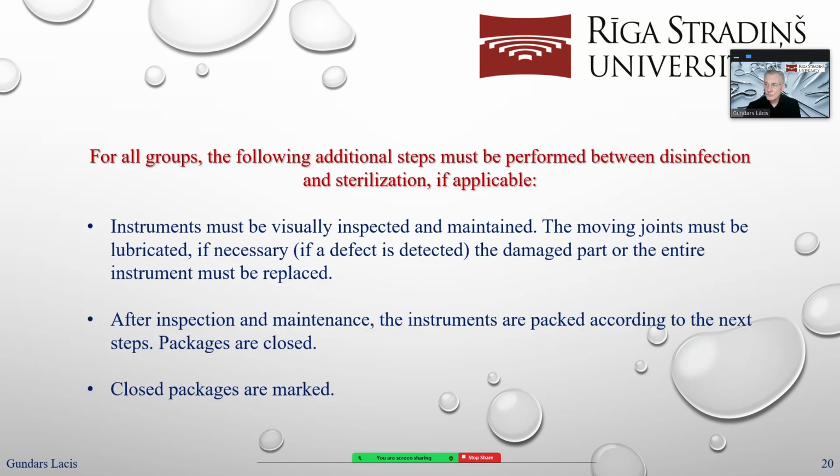But for all those groups, between disinfection and sterilization, several steps are performed. Instruments must be visually inspected and maintained. The moving joints must be lubricated if necessary, or if we see a defect, the damaged part or the entire instrument must be replaced.